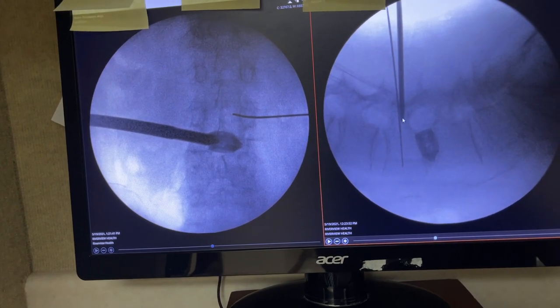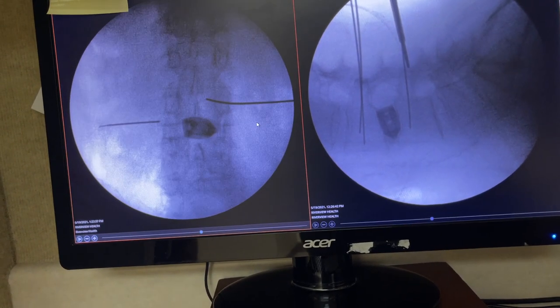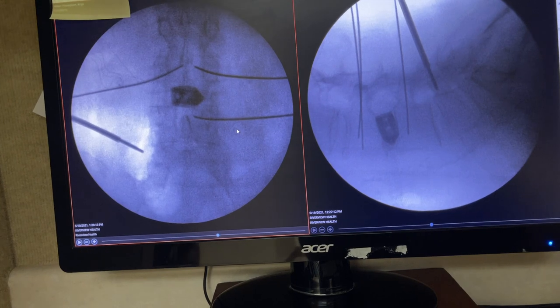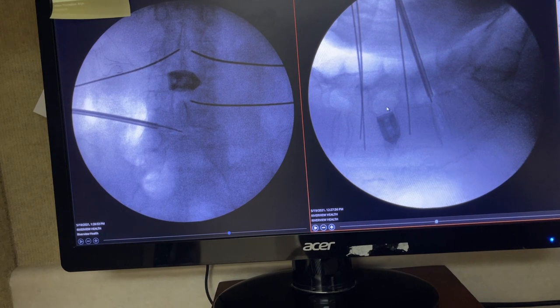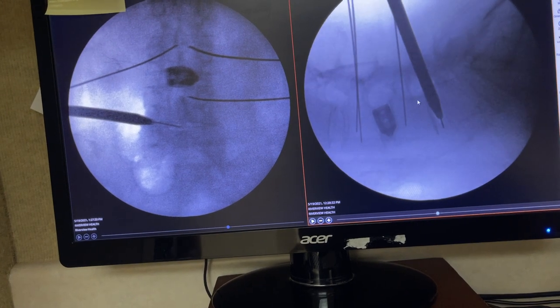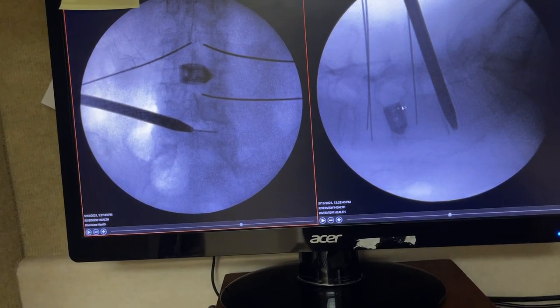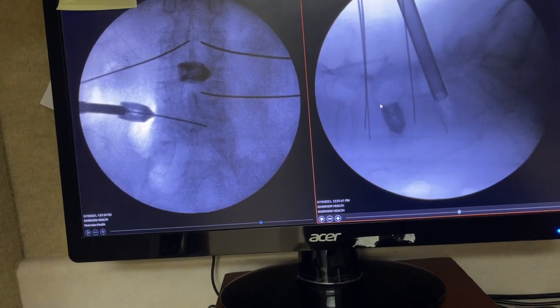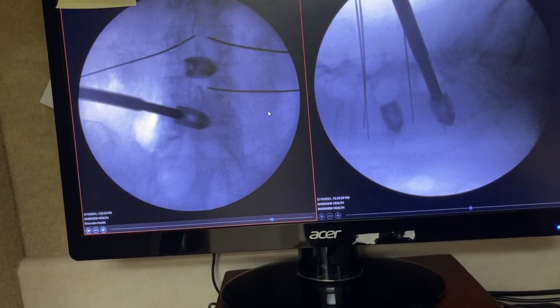In the same way, because we have a good pedicle view, I put some other pedicle screws while waiting for my staff to do other things on the back table. Then I approach the disc below, same way — I stimulate at three milliamps, I am good at four milliamps, I put the K wire in, and then I dilate. Again, you see the opening of the foramen when the dilator goes in, same disc preparation, and then the cage goes in. This action again is what opens up this space.